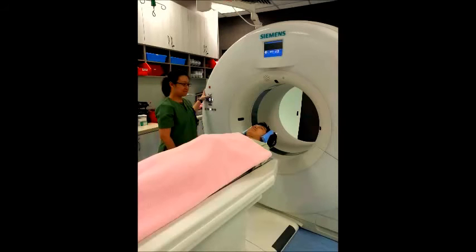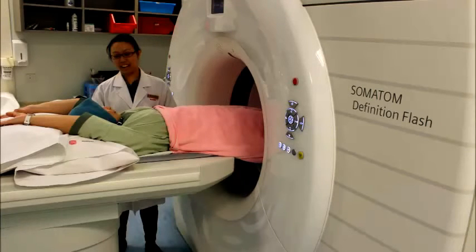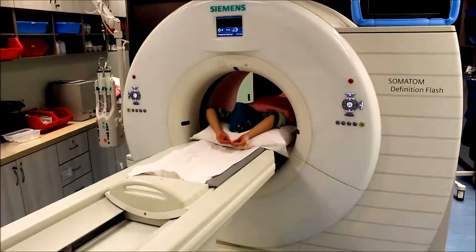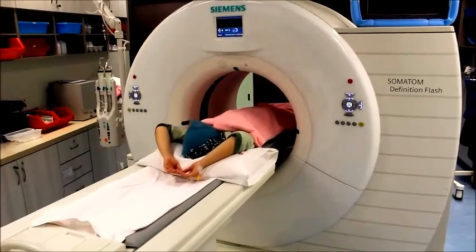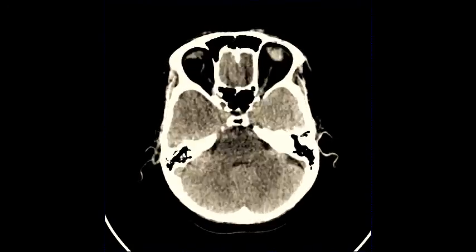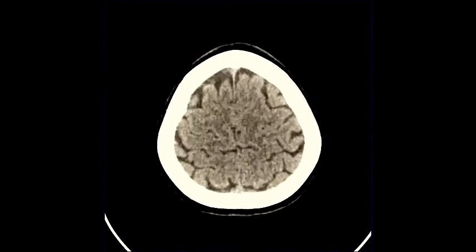The patient position during the scan could be head first or feet first. Instruction may be given in certain scans. The radiographer needs to check the images before letting you out of the scan room. After the long fasting for contrast enhanced CT, now you are allowed to resume your diet.